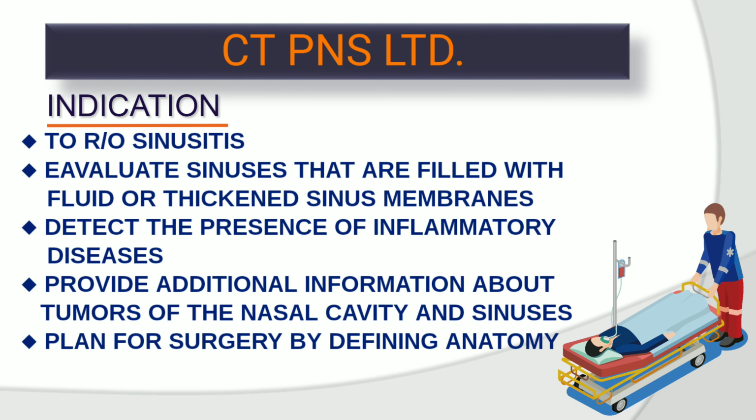Indication: to rule out sinusitis, evaluate sinuses that are filled with fluid or thickened sinus membranes. Detect the presence of inflammatory disease. Provide additional information about tumors of the nasal cavity and sinuses. Plan for surgery by defining anatomy.